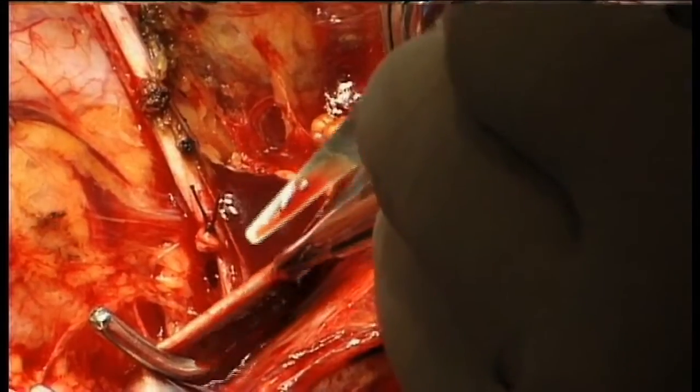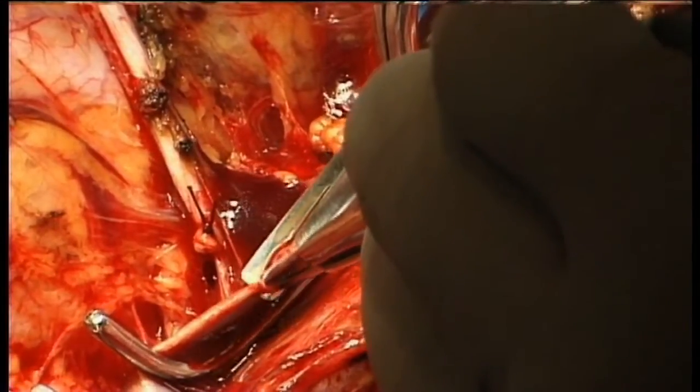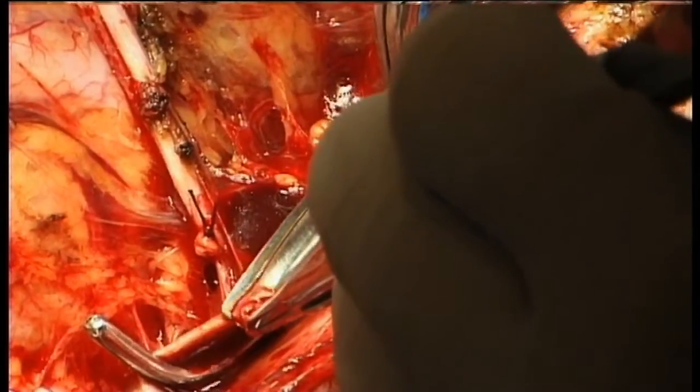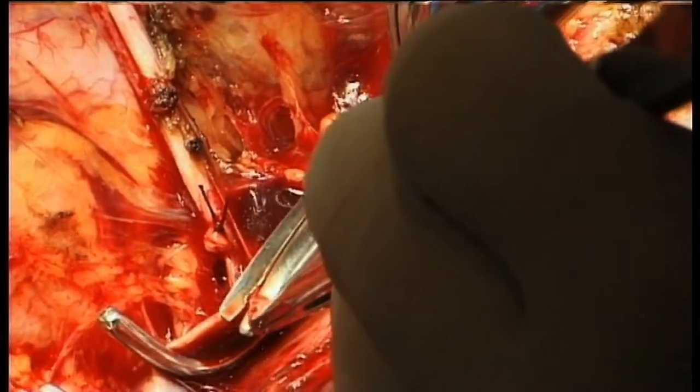The external iliac vein is clamped using a Swinney-Satinsky clamp, and a buttonhole at its anterior surface is carried out.